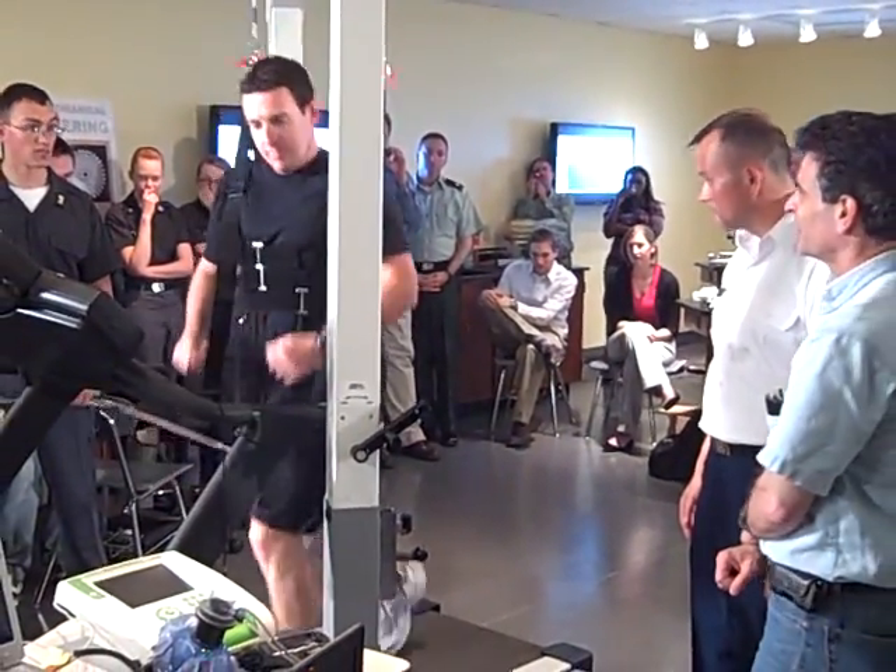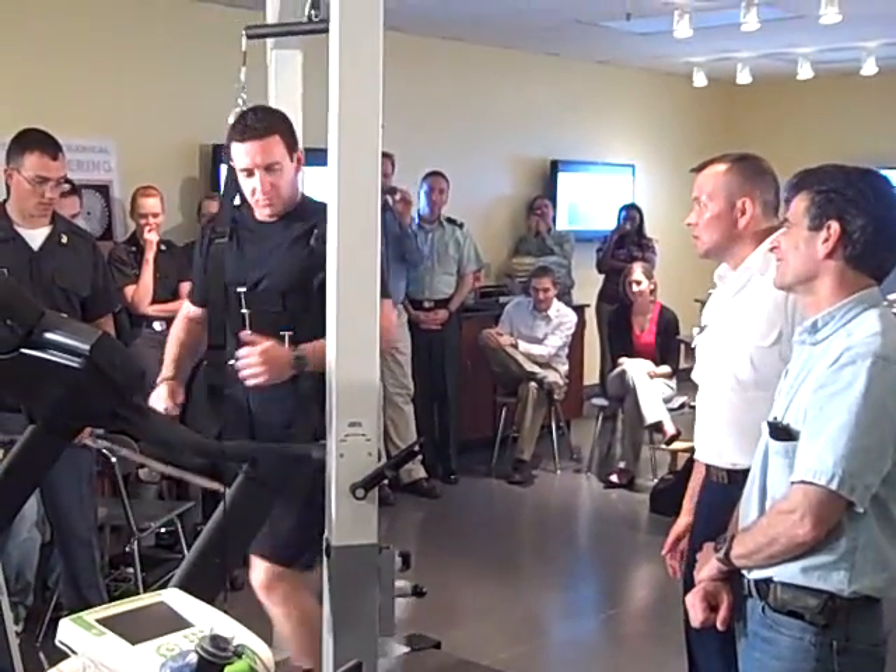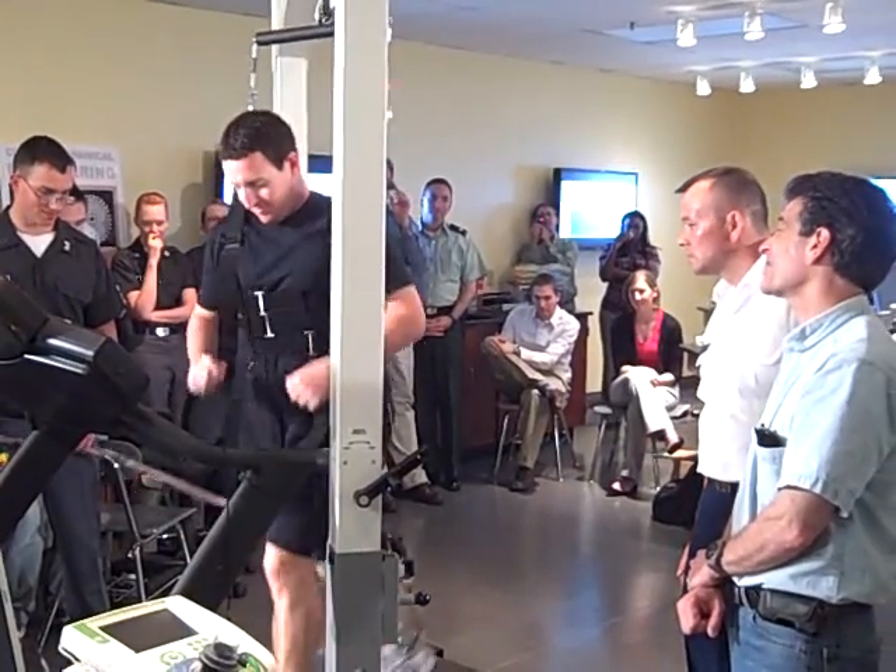How does it feel, John? It feels good. The natural ones feel — the best ones feel hard. One of them is getting tired.